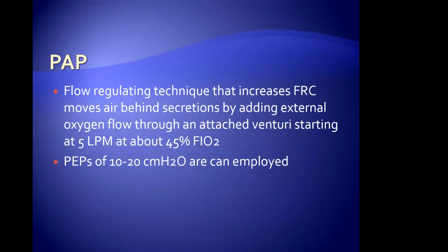And again, positive expiratory pressure, 10 to 20 centimeters of water pressure, can be employed. So what does that mean? How many of you use PEEP on your mechanical ventilator? Everybody. Everybody uses PEEP. This is nothing new to us, but now it's in a handheld device. It's been out for a long time, but use these things.